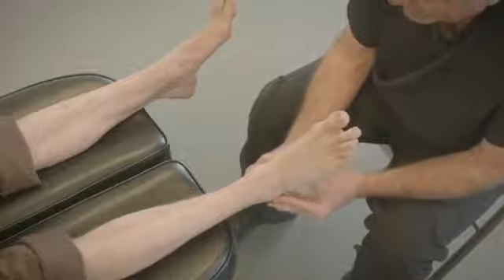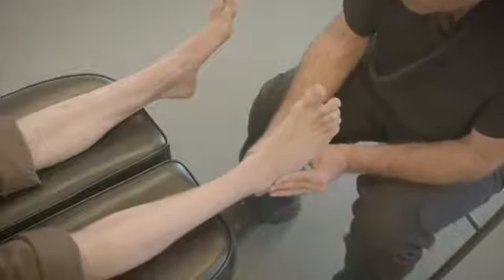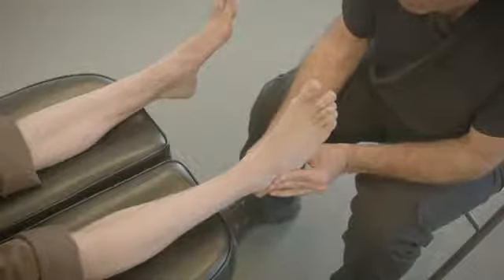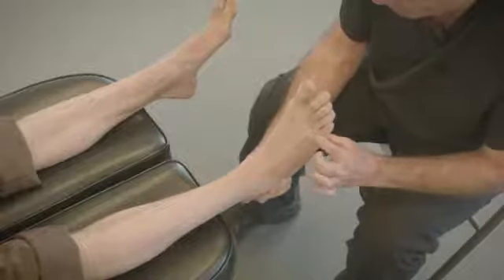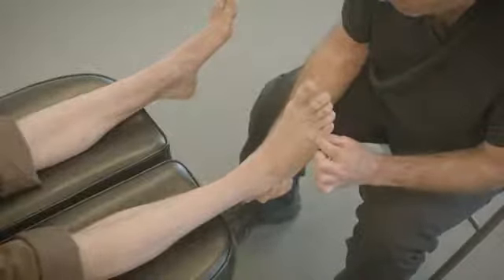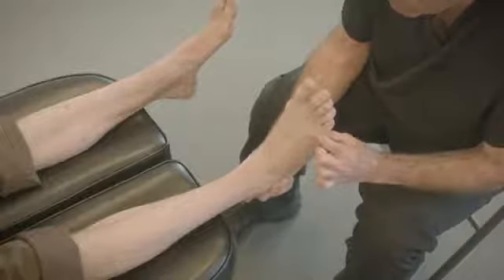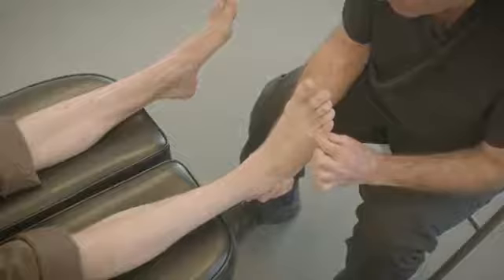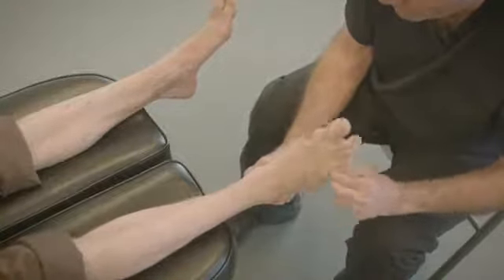When I cast your foot for your orthotics, I'm going to correct your subtalar joint. I'm going to realign your heel properly, and I'm going to load your mid-tarsal joint so that it is stable. This position is what the foot orthotic will correct your foot to. A stable, solid foot compared to a loose, unstable foot.